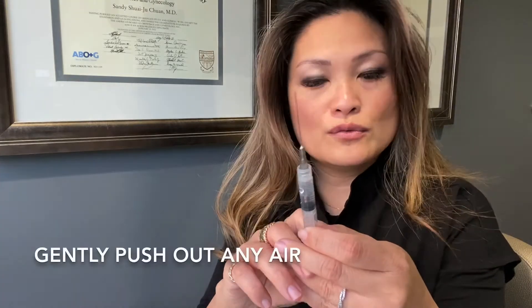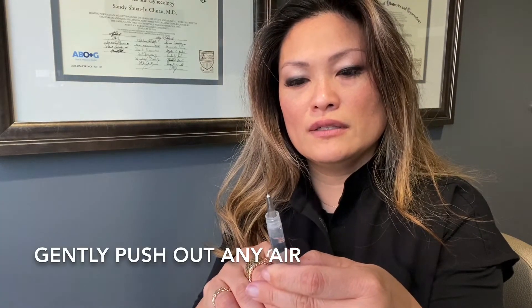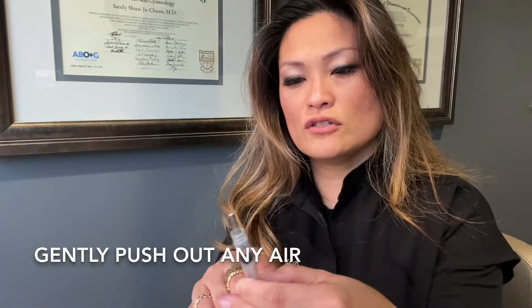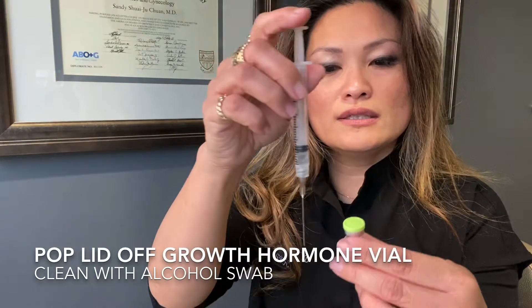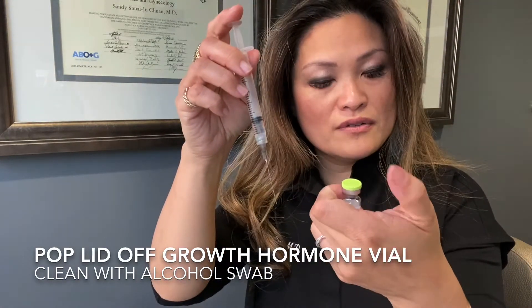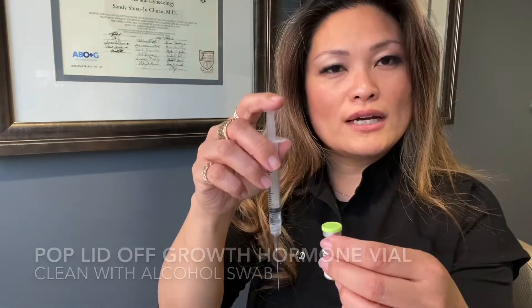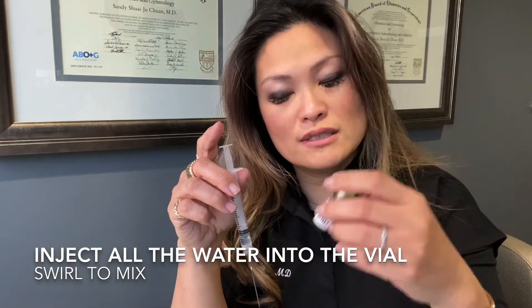If for whatever reason you have air in it, you can always just push the air out, like we taught you with the Menopur injections and the other injections. Then take the whole volume, clean the top of the Omnitrope vial, inject it into the powder, and gently swirl it to mix.